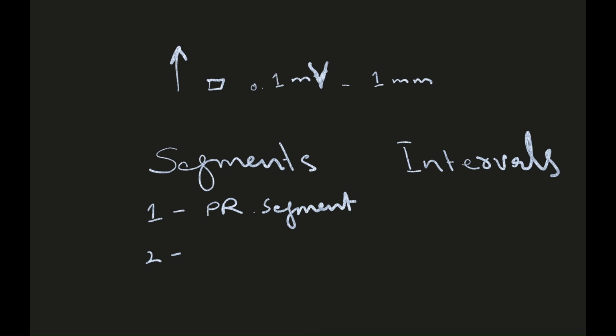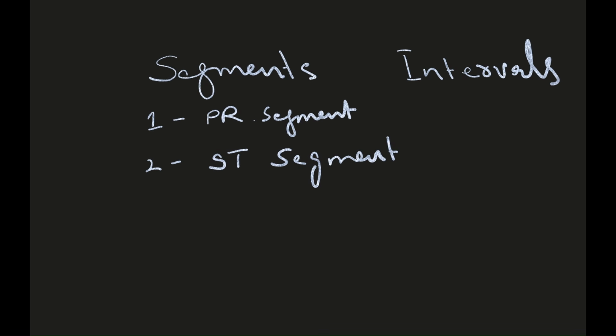And the other segment that is very famous and everyone knows about is the ST segment. You already know what the ST segment is. If I draw the QRS complex, the ST segment is at the end of the S wave and at the start of the T wave.